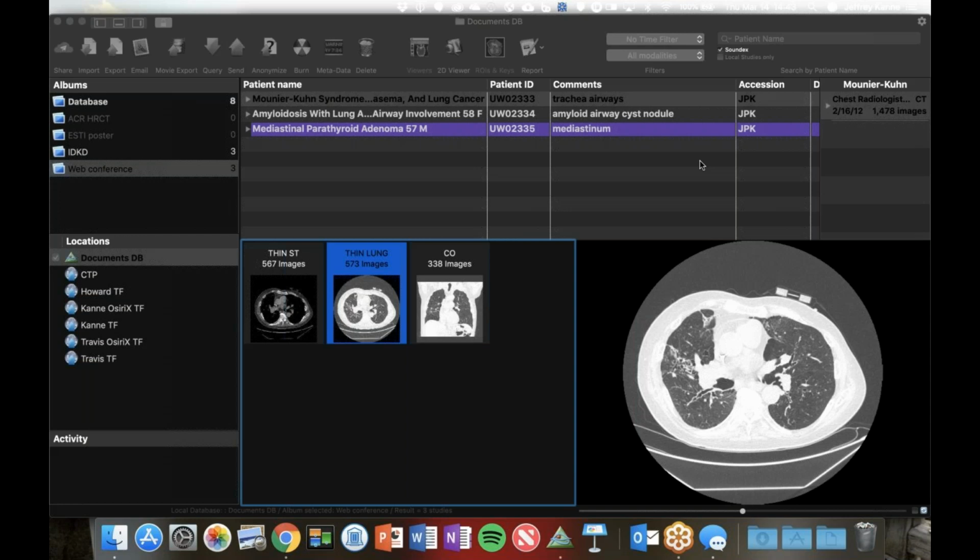It'd be interesting to see how floppy his trachea is when he breathes. Yeah. It would be nice to see it, but when the history is pulmonary hypertension, we don't usually add expiratory images. There is no mention about anything else in the order at the time. But yeah. Okay, well, those are my cases this week.